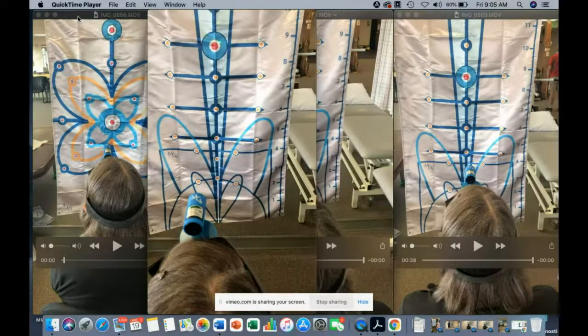And so we were looking at some ocular motor reflexes, going through saccades, general smooth pursuits, and VOR. I wanted to show the series of testing and treatment during her VOR, since this is going to be involved in dizziness. Now, she had such a significant attack that it impaired her activities of daily living and her quality of life. She's now on a walker for fear of falling. She can go short distances, but she always feels like she's off with those.